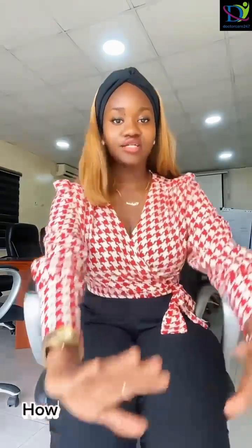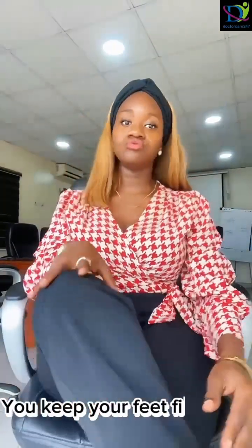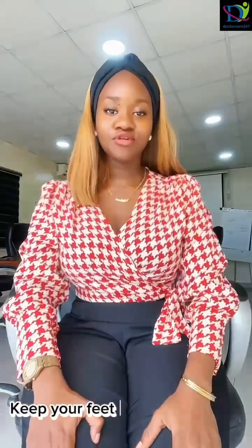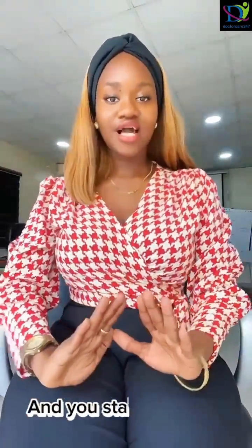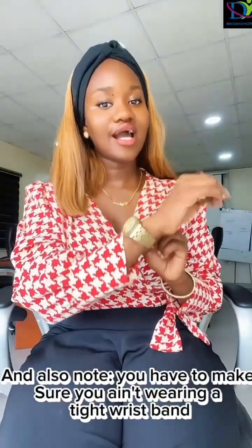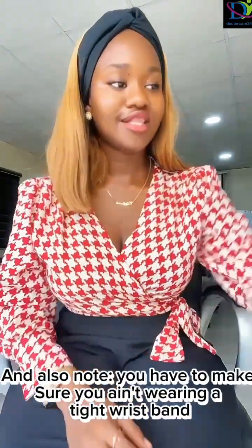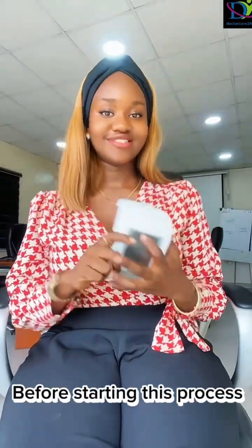And then how you do that is you keep your hands on the table, you keep your feet firmly on the floor, do not cross your legs. You keep your feet firmly on the floor, your hands on the table, and you stay quiet and relaxed for 5 minutes. And also note, you have to make sure that you are not wearing a tight wristwatch. You might even decide to remove the wristwatch entirely, and make sure your blood pressure machine is working really well before you start this process.